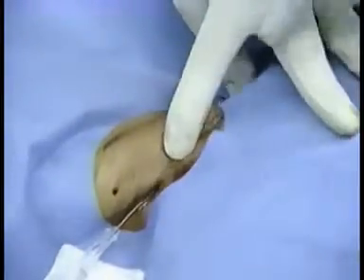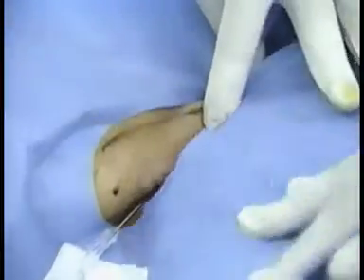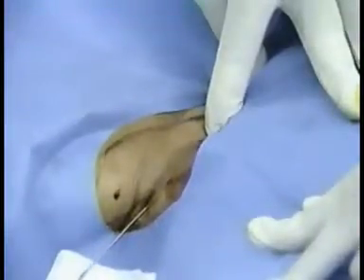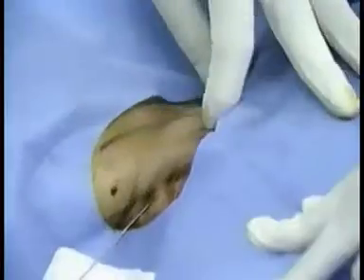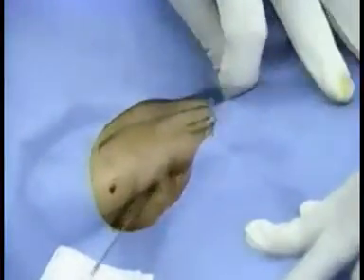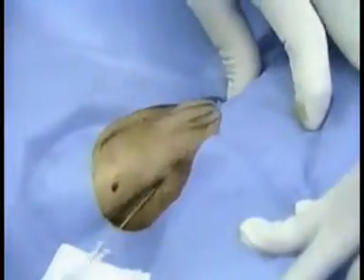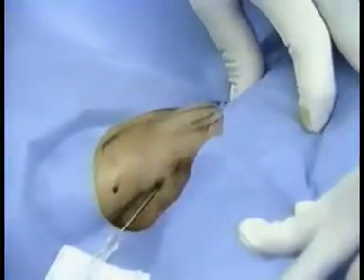Advance the needle slowly with negative pressure on the syringe. If the initial pass is unsuccessful, withdraw the needle, palpate the sternocleidomastoid muscle to confirm you are in the right place, and redirect the needle slightly more inferiorly.